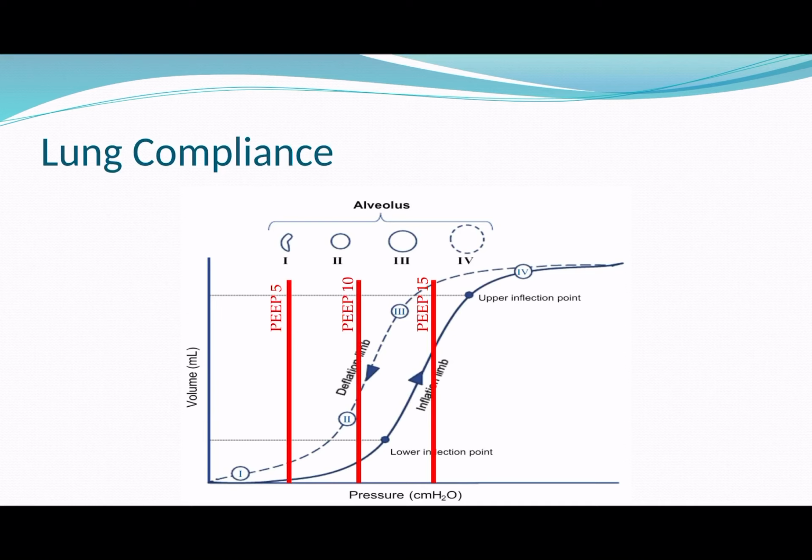And so this is why you shouldn't particularly be worried about having these big, high pressure, high levels. Because the reality is you need to treat the patient in front of you, and it depends entirely upon the compliance of their lung. If their lung's very uncompliant, there's a lot of disease, which is usually the case in patients being put on APRV, they may well need that higher positive end expiratory pressure, or PHigh, to just keep the lungs at a point where they're the most compliant for them.